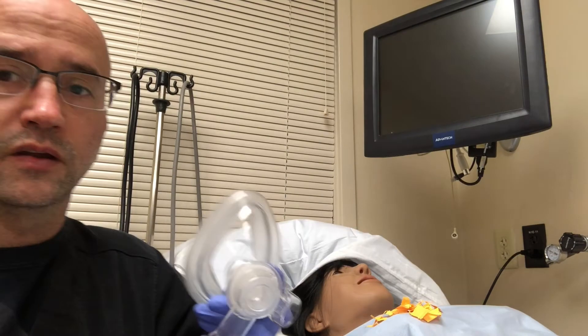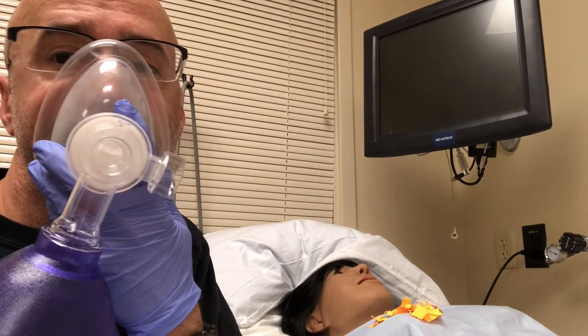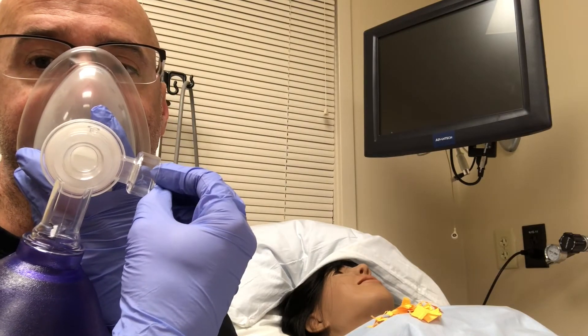Observe. Patient being bagged. Air coming out.